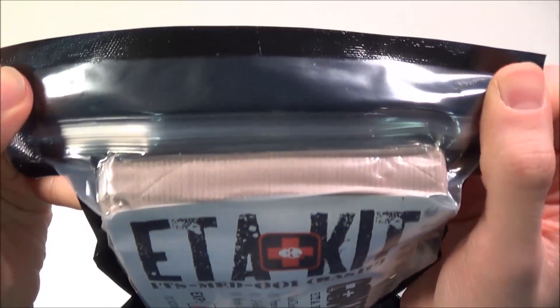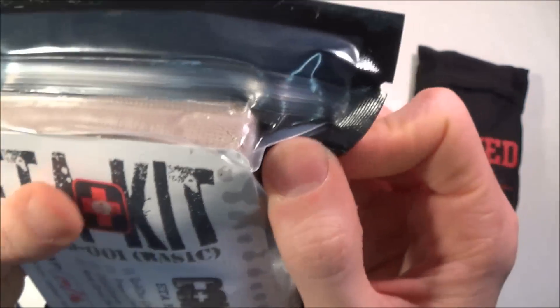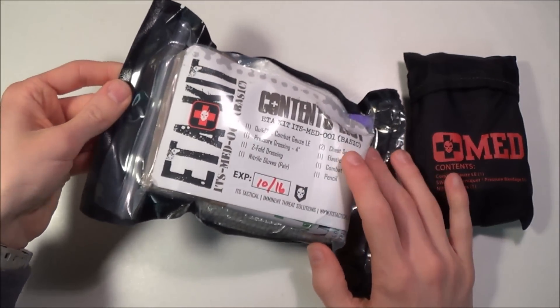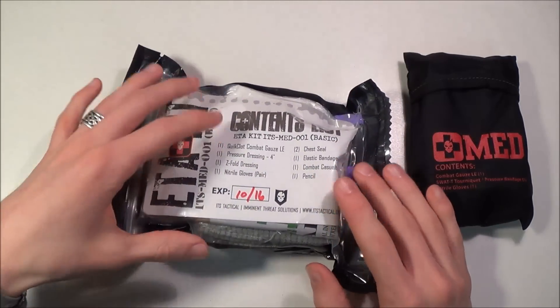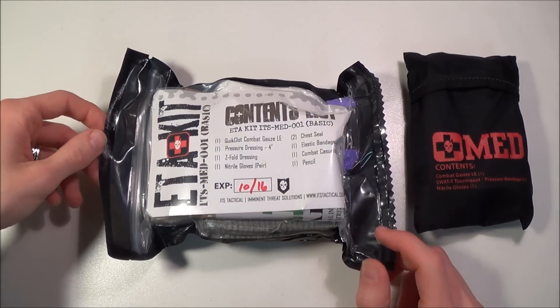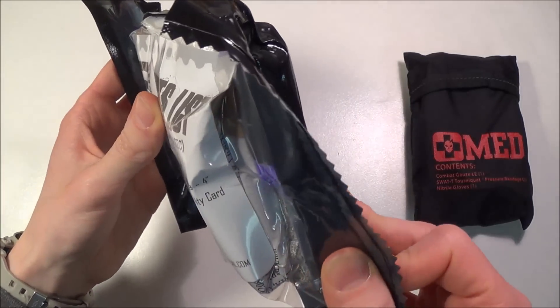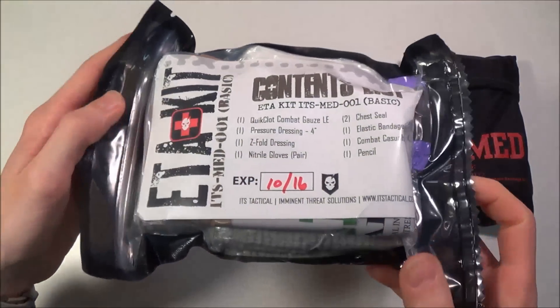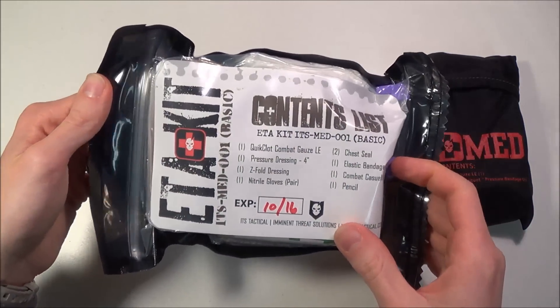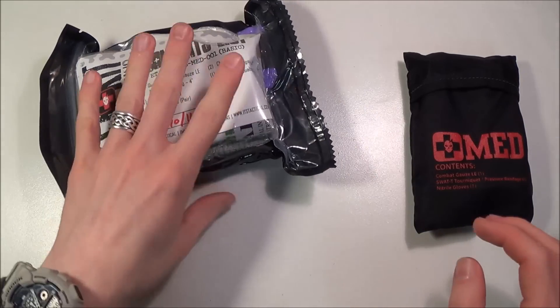This vacuum-seal pack is resealable — it has a kind of zip-lock deal going on up top. There's where you would rip it open, get some of your contents, and if you only need a couple of things, you can just seal it back up. I will do a video opening this up and showing you guys the contents individually. I really don't think it will ruin the sterility because most of the things in there are individually wrapped anyway.